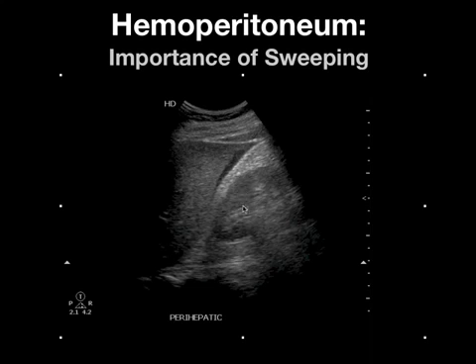Now, in a potentially stable patient at a level 1 trauma center with full resources around you, who was going to get a CT anyway, the detection of this small amount of fluid may have had no clinical bearing. However, if you're at a non-trauma center where the detection of any hemoperitoneum means transferring the patient, or if you're in a disaster setting where you've got multiple people you're trying to triage, recognizing the presence of hemoperitoneum could help you in better triaging this patient.